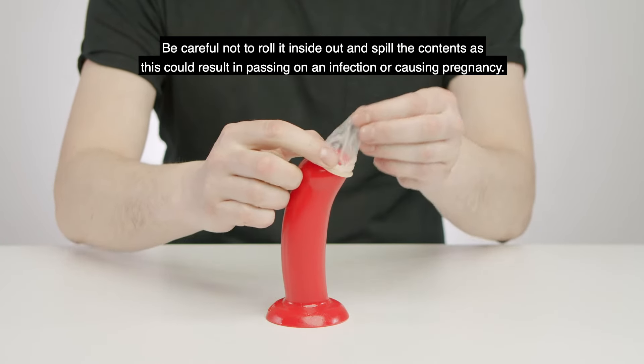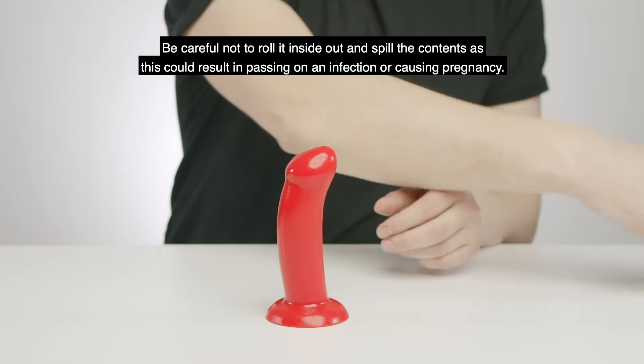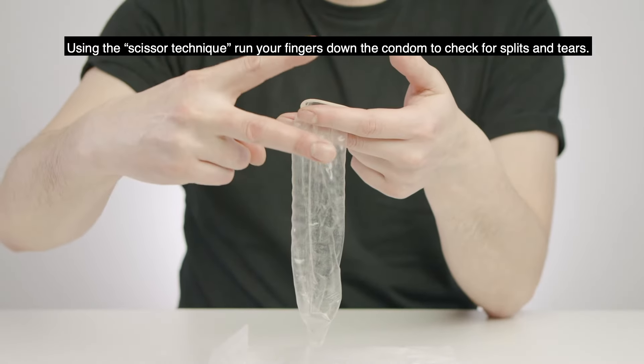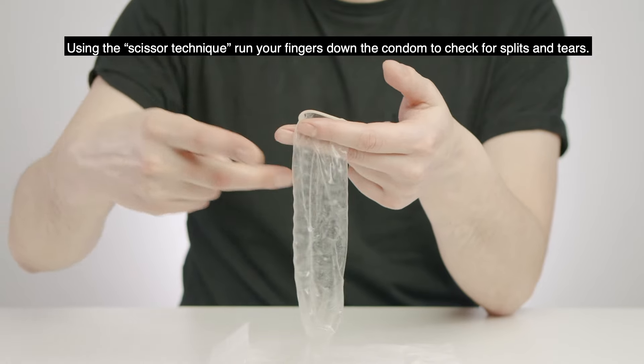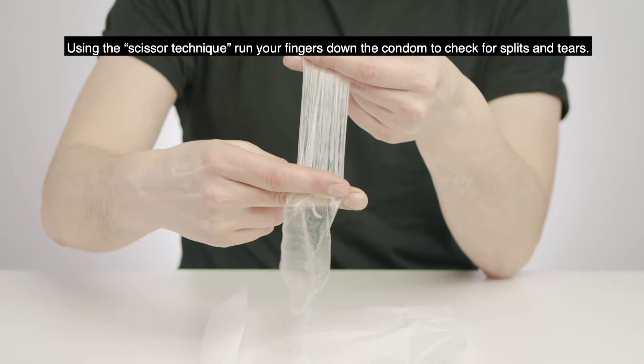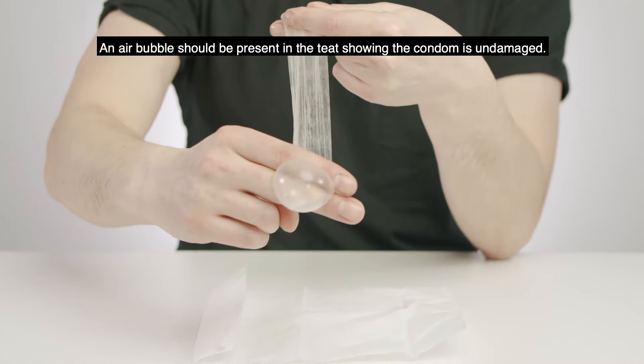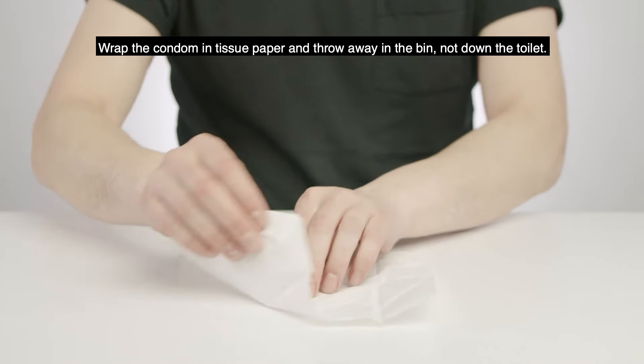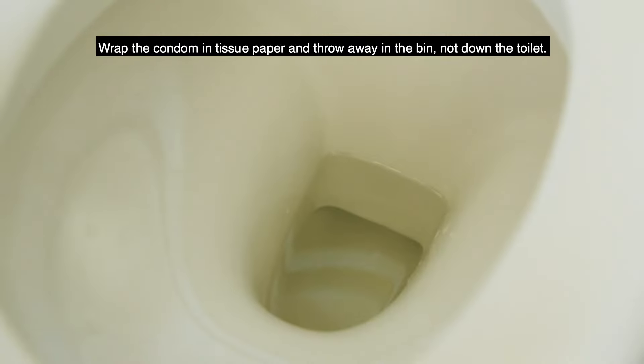Be careful not to roll it inside out and spill the contents, as this could result in passing on an infection or causing pregnancy. Make sure the condom is well away from the genital area. Run your fingers down the condom to check for splits or tears — an air bubble should be present in the teat showing the condom is undamaged. Wrap the condom in tissue paper and throw it away in the bin, not down the toilet.